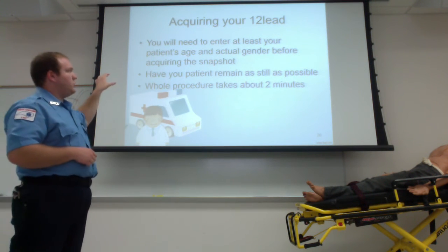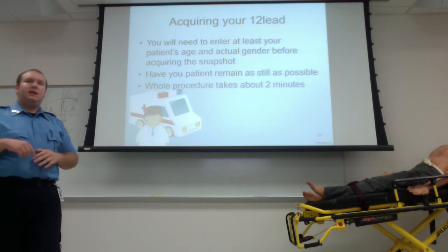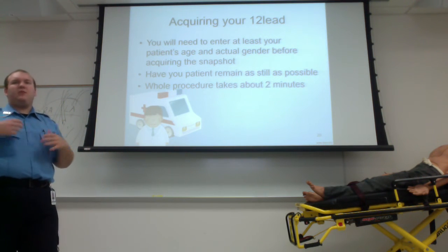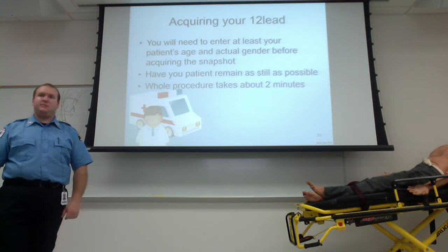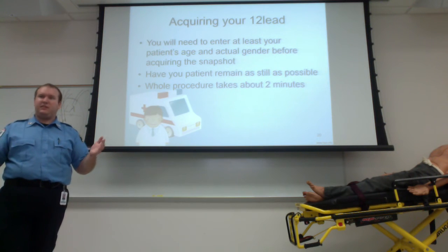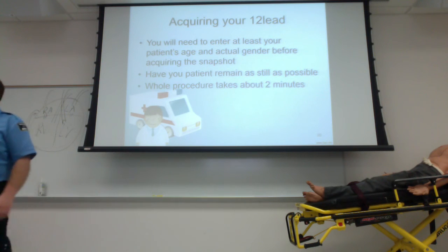And once you have everything else put in, putting the information in the monitor does not take long at all. Then you'll hit acquire. Before you hit acquire, have your patient lie as still as possible for roughly 10 seconds, just a good time frame to tell them. It'll take that picture real quick. It will take 10 seconds to take the picture, and then it'll take a second to think and print you out your reading.